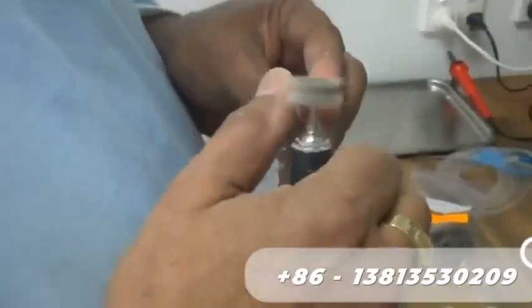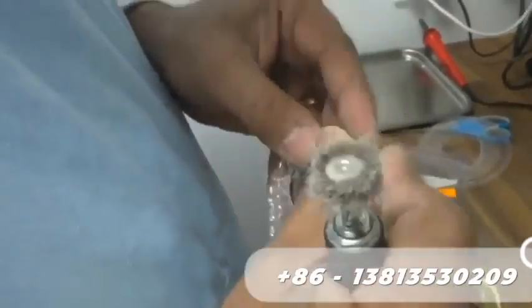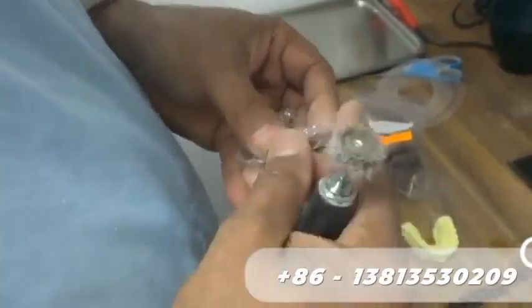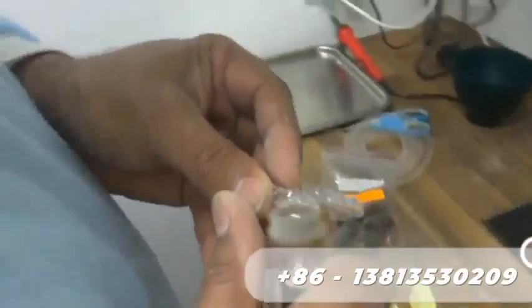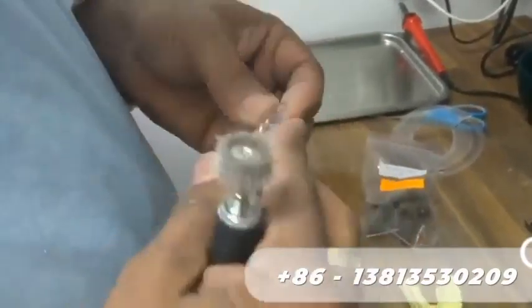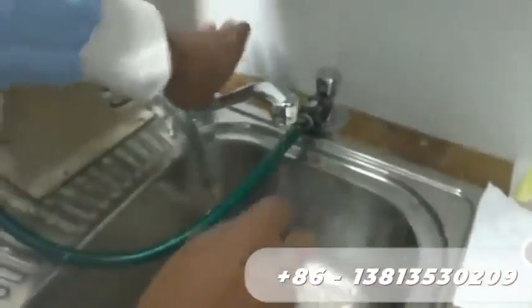Once that's done, I normally just go around with my finger, like so. There we are, see? Just go around with my finger and make sure it's all nice and smooth, which it is. And then we give that a rinse, and we stick it in one of these containers.